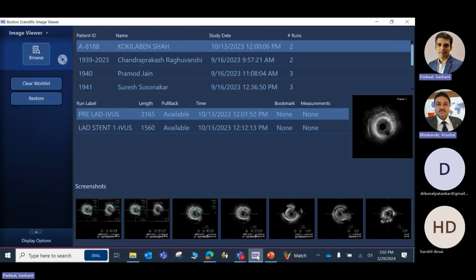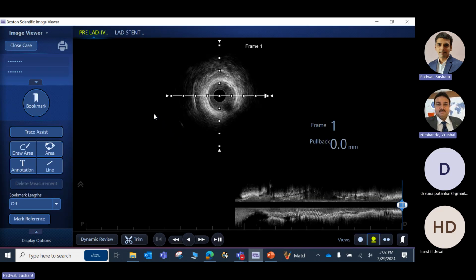Are you now familiar with what we have discussed on the MDU side? That will give you the length, and the landing zone where you are getting a healthy zone. Now, on this cross-sectional view, can you see the dots? Each dot is 1 mm apart. Suppose now you are at this level.